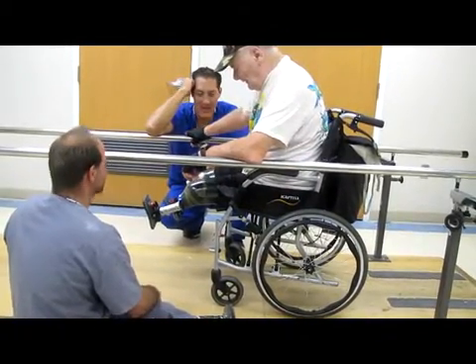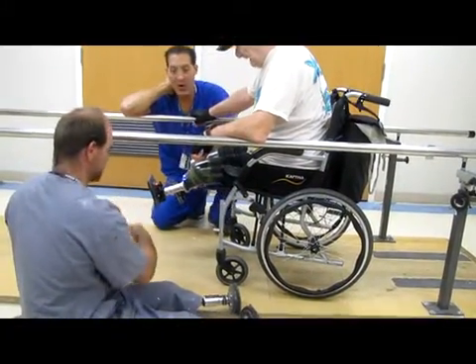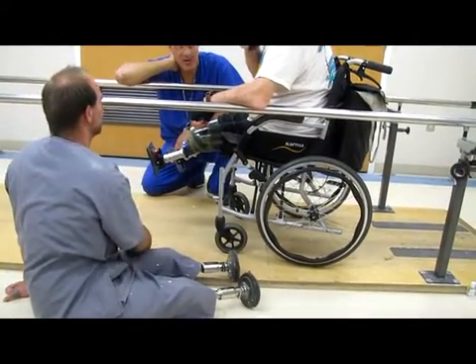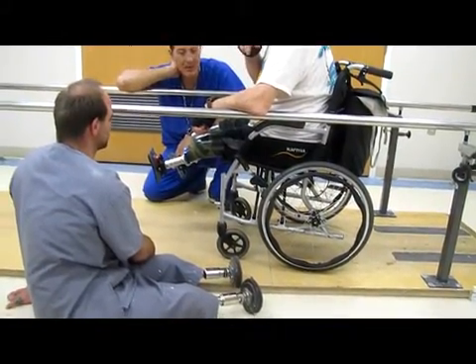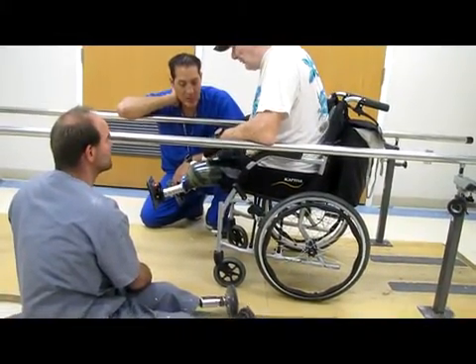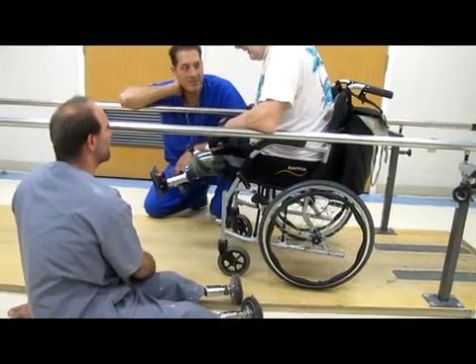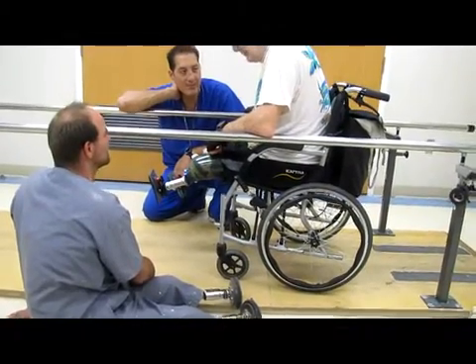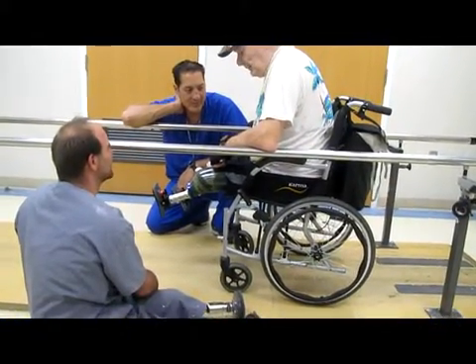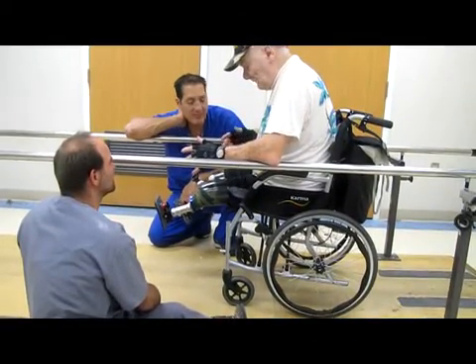Yeah. Maybe that's where a little more length would help. On this side, you think, or overall on both? Yeah. So the hips are higher, and then to get back into the chair. Sure. Yeah, we could lengthen both of them. Would that make things more difficult to walk or easier? I've always thought in my mind that the shorter they are, the easier it would be. For that reason, maybe I've had a crush on those stubby boots. They look as if they would be the easiest means to get around, and if I were to fall or something, I'm that much closer to the ground.